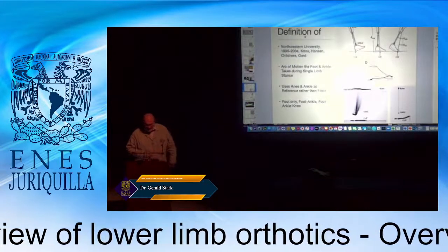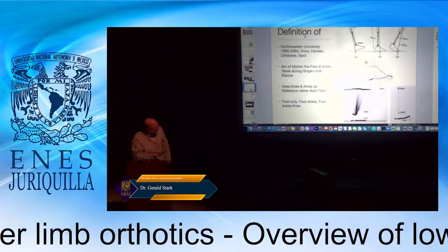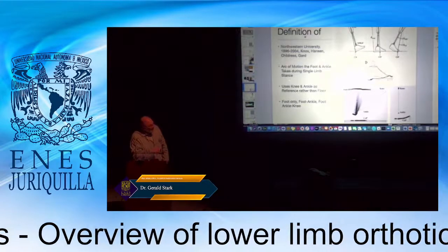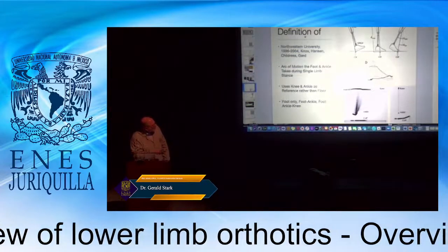So the definition of the rollover shape, as we mentioned before: if we look at the center of pressure with the shin, and we now hold the shin, let's say we attached a GoPro to the shin, then we can see how the rocker shape of the foot arcs.